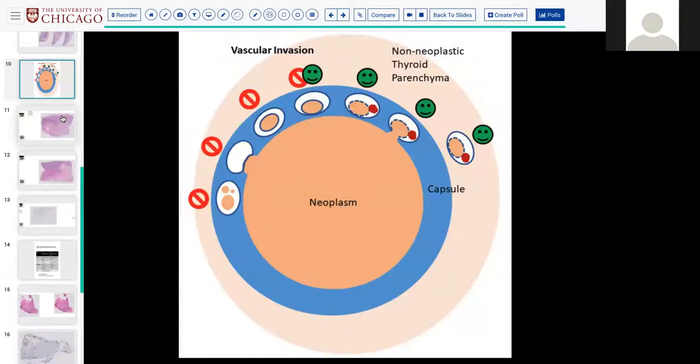So my angioinvasion is also happy. So, you know, when you have floating tumor in a vessel without endothelium and without thrombi, this could just be pushed fragments, artifact in a vessel.